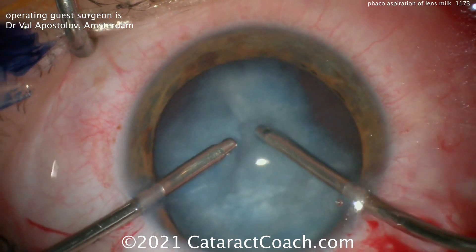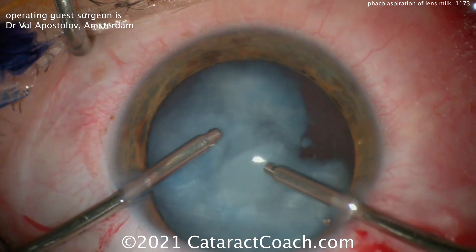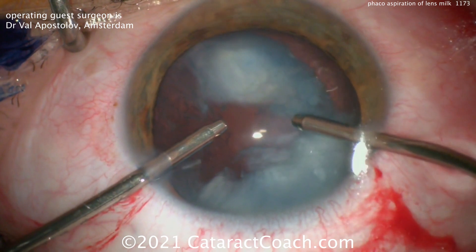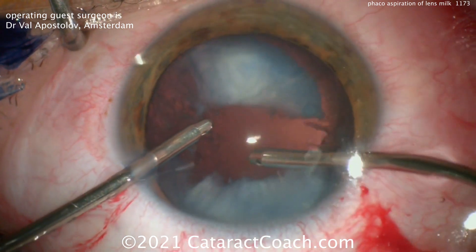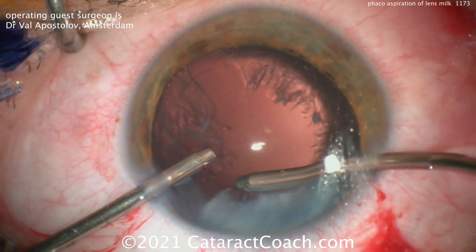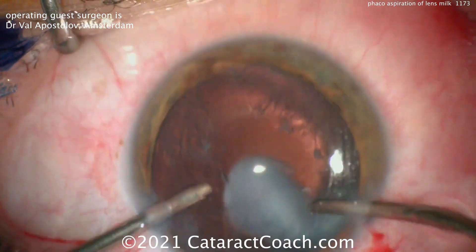Aspirating all this out — it comes out pretty easily. Then we'll enlarge that rexis. We've shown in the past you can enlarge it before inserting the lens, or you can actually enlarge it after inserting the lens.